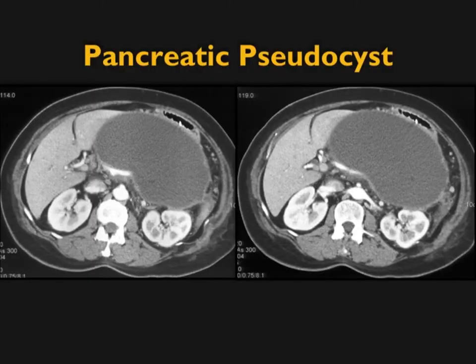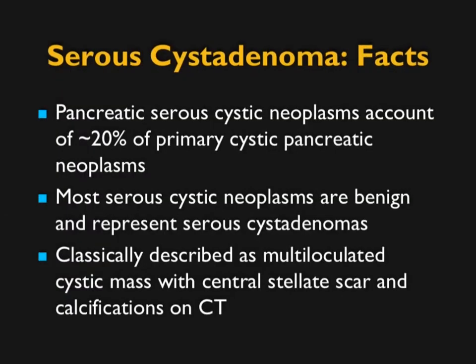Here's a large pseudocyst in the lesser sac — a very classic example. Now, serous cyst adenomas are one of my favorite lesions. The problem is sometimes the diagnosis is easy, and sometimes it's hard. The biggest challenge is the many different appearances: the classic, the almost classic, and the strange and hard to believe. They account for about 20% of primary cystic pancreatic neoplasms. Essentially they're almost always benign, but they can cause mass effect and duct obstruction. Classic features include scars and calcification, and they're more common in middle-aged and older females.